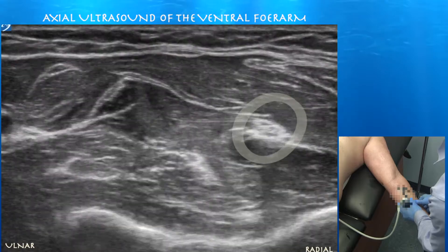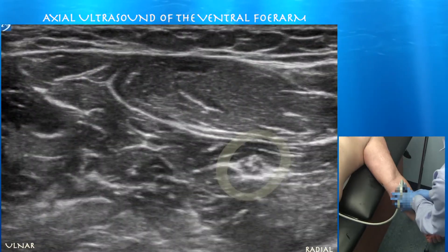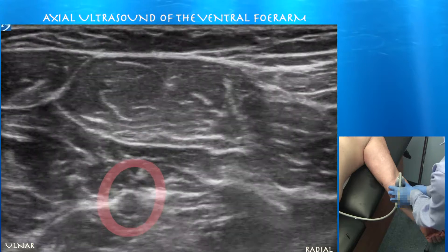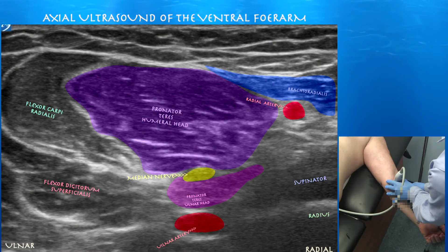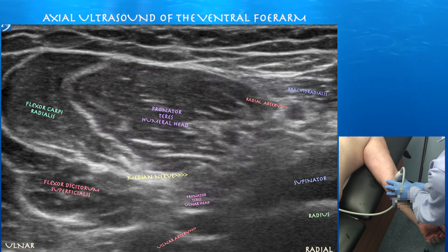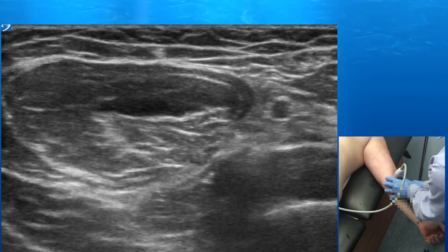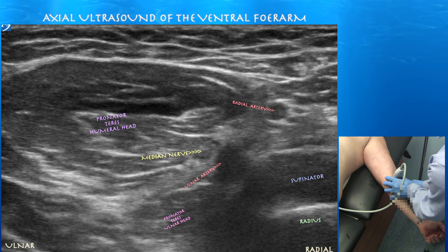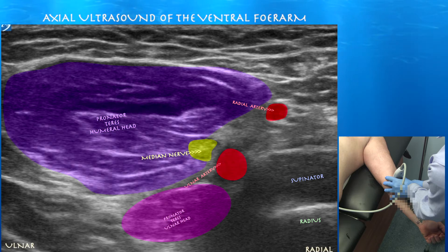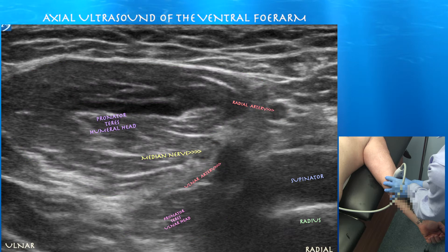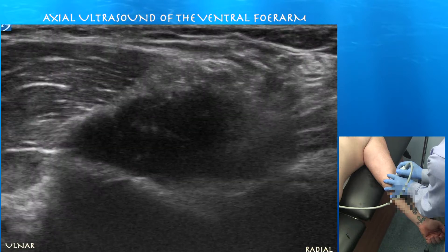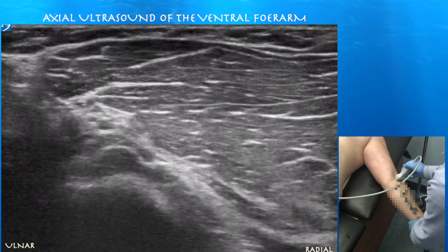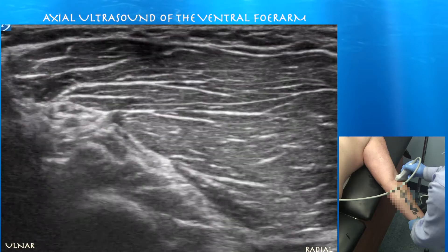Here again we're looking at that median nerve as we're going proximally up the forearm. You can actually see the ulnar artery going from an ulnar to radial direction as we're going proximal. Here you can see the pronator teres ulnar head sitting between the median nerve and the ulnar artery. You can appreciate the two heads of the pronator teres muscle. Also you may be able to tease out the common interosseous artery branching with the ulnar artery as you go proximal, but it's difficult to really tease out here.